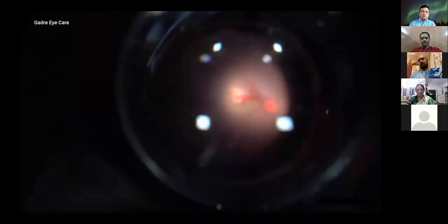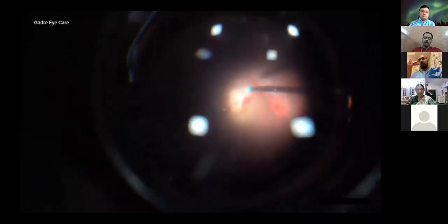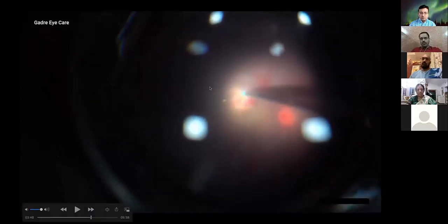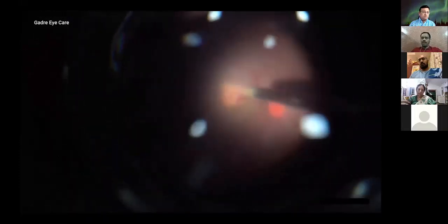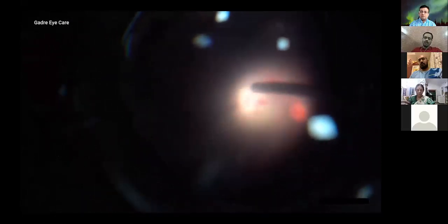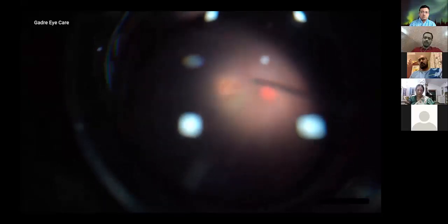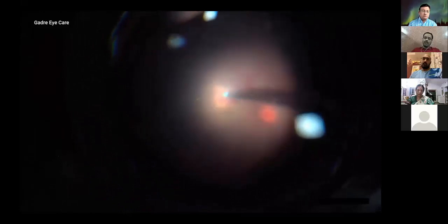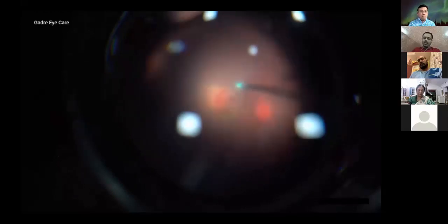But again, nothing came up, just a small speck of heme, which I cleared, and decided to prod on, considering that the visual outcome, since it involves the fovea, is guarded. There you see a small hole-like thing just below the silicone tip of the back flush. I had a weird thought that, being a very small foreign body, whether it had exited through the fovea. I tried the back flush with active suction, trying to pull out if something is stuck below the RPE or subretinally or in the sclera, hoping that it might come out. But in the end, nothing came out.